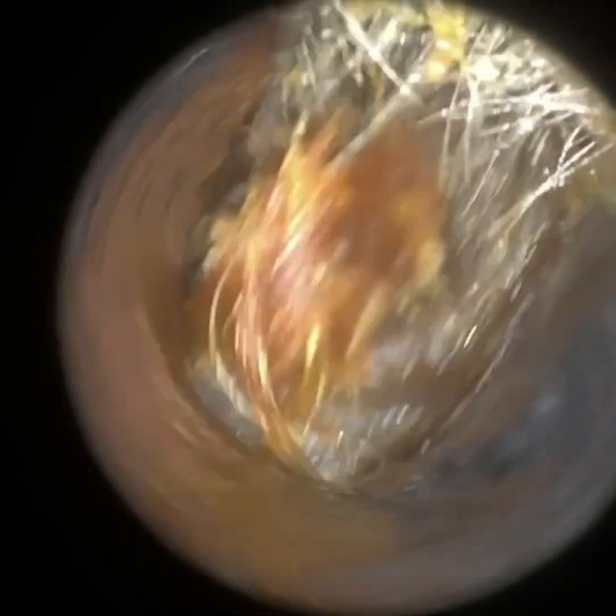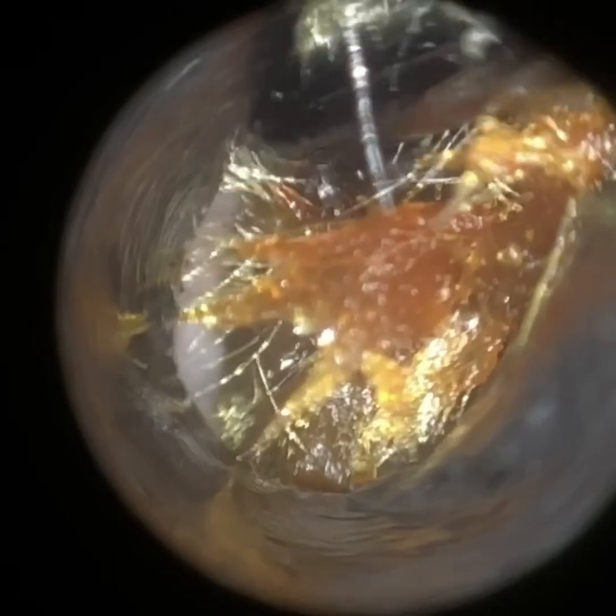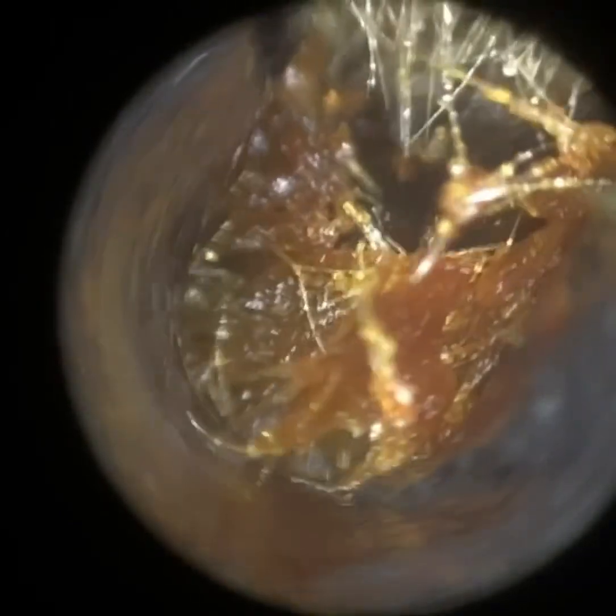I'm just trying to bring it up as well, because as you enter the ear canal there's a decline in the orientation. So I'm just trying to lift it up and away, going back to the rear hook. It's kind of matted wax. I'm just bringing this up — you can see some of it has come away.